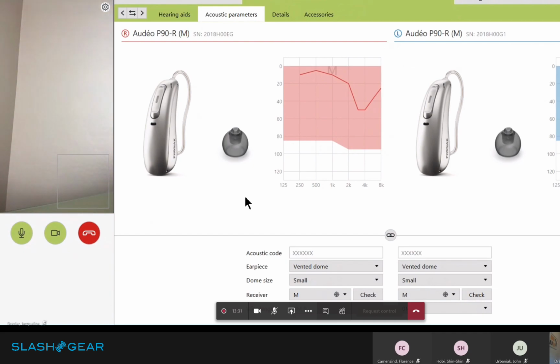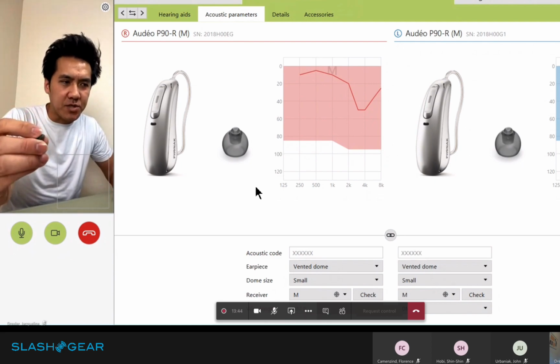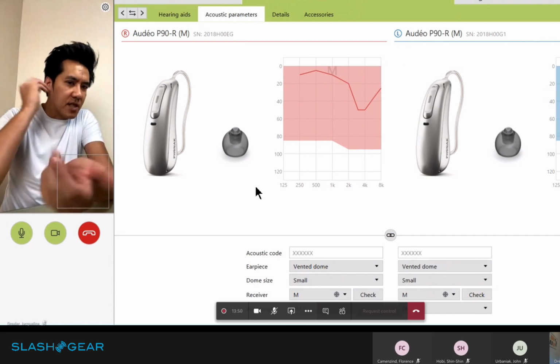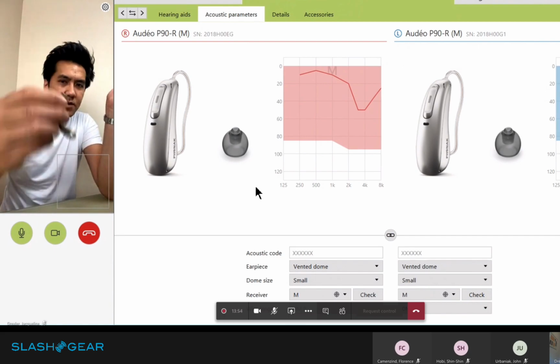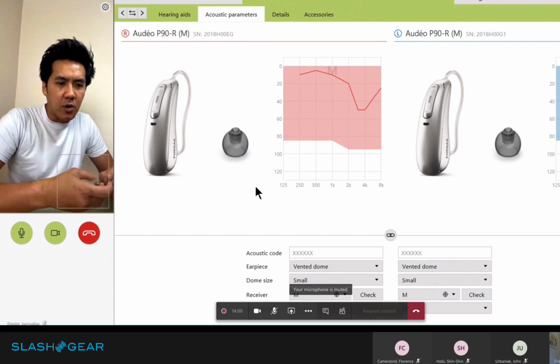Do they matter? How it's programmed, does it matter if I'm using that one or if I'm using the smaller one? Because the one that came with it keeps sliding out of my ears. So that's why I found a smaller version that was sent a while back, so I'm using that now as a test. So does the sound output?